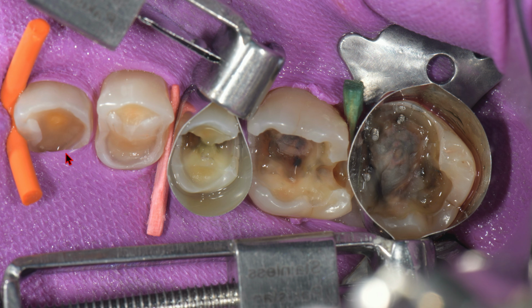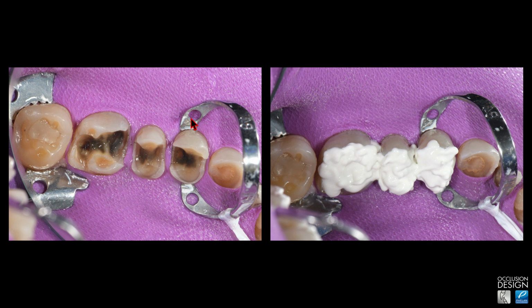And speaking of the cores, we had multiple cores to do in this case that day. It was a lot of work. You can see different clamps being used. I'm again using core paste, Denmat's core paste, which is self-cured. I've used this for so many years and just had tremendous success.